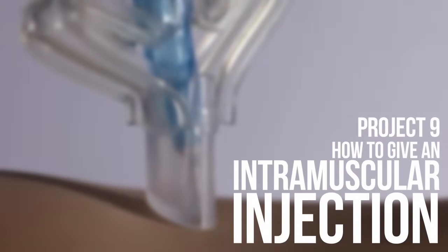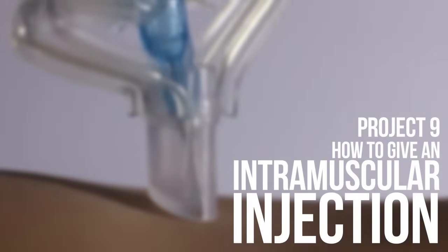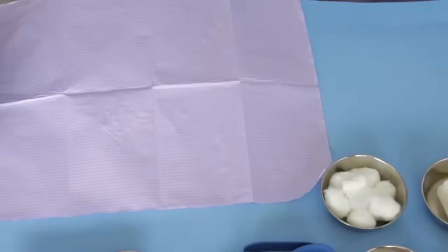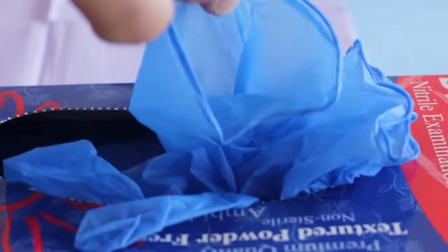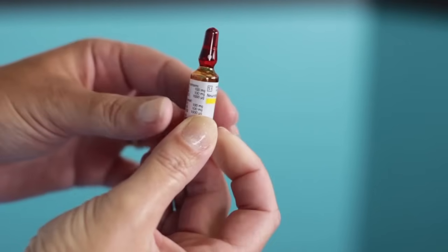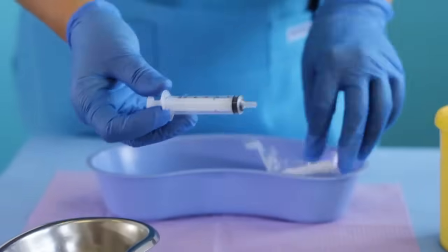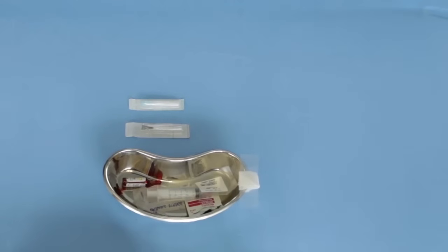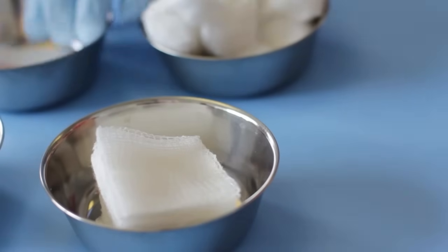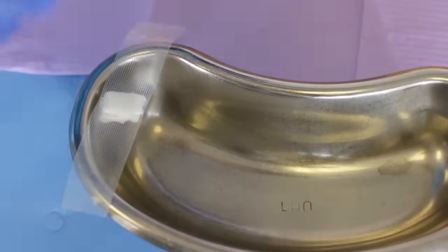Medication is injected well into the muscle layer below the various layers of skin. You will need a clean work surface cover, an alcohol wipe, a pair of clean gloves, a vial of medication, a 5cc syringe, two 18 to 20 gauge needles — one should be a safety needle — a vial, cotton wool or gauze, and an adhesive bandage strip.